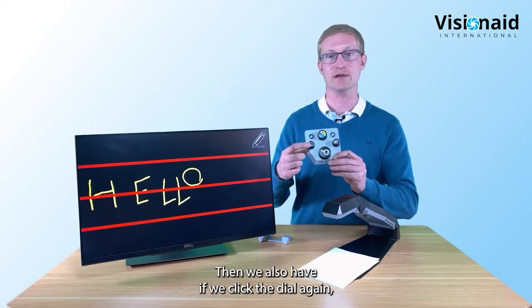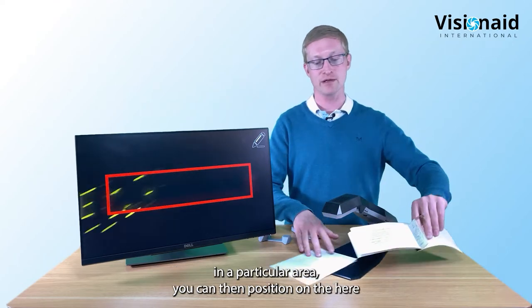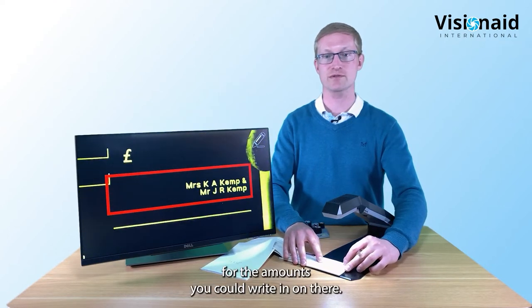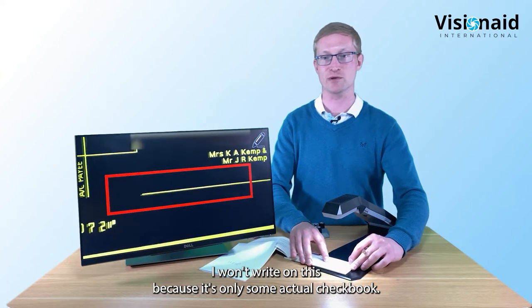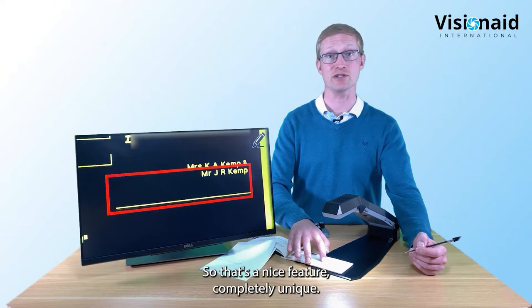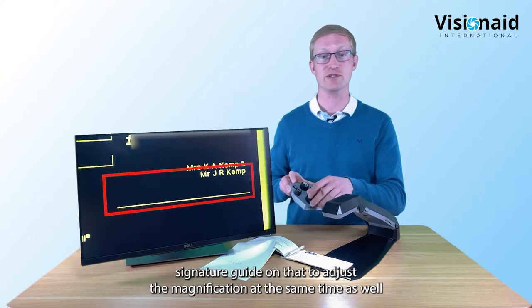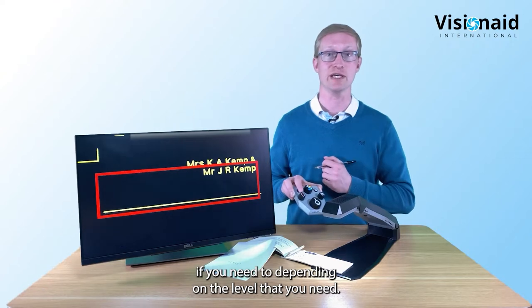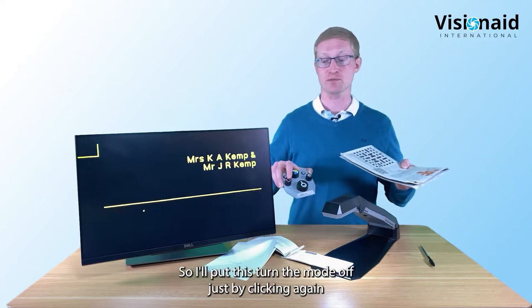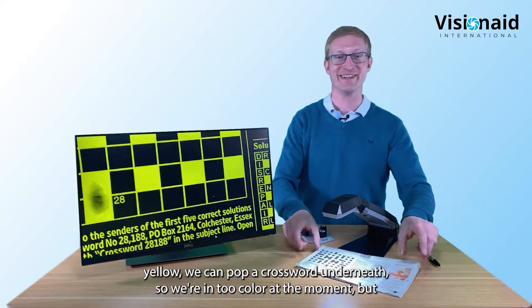Clicking the dial again enters a signature box mode. If you have a checkbook where you need to write in a particular area, you can position it under the camera for the amounts field and then the signature line below, making sure you get your signature in the right area. You can also change the size of the signature guide by rotating the dial. Now let's look at writing underneath a crossword.